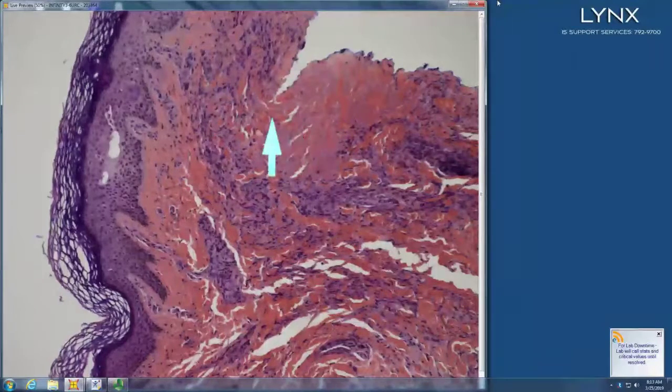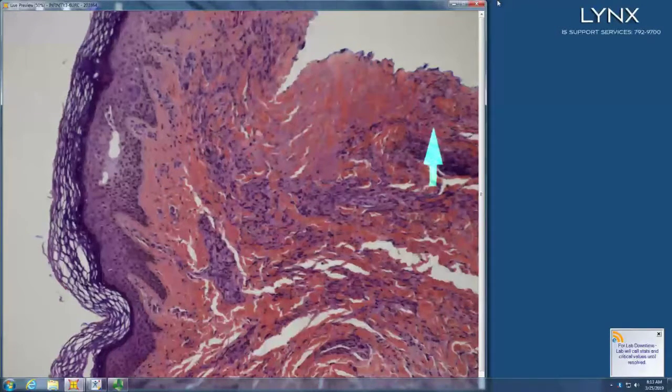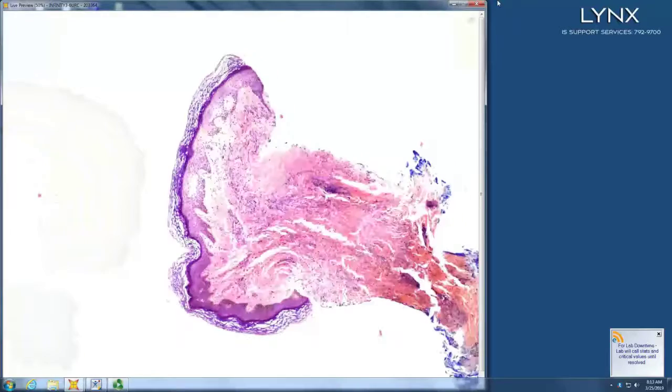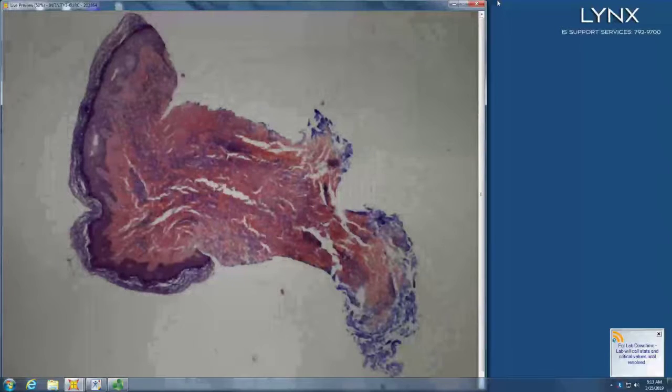Healthy or unhealthy collagen? It's pretty unhealthy. With something kind of lined up around it. Yes, some palisaded necrobiosis. Yep, so this is deep GA. It's probably GA, kind of focal patchy throughout the dermis.